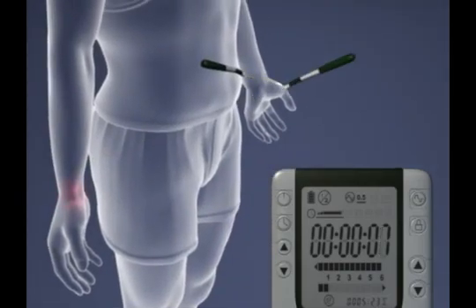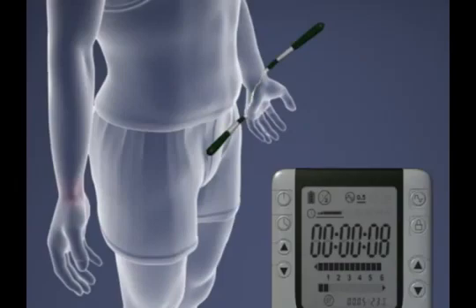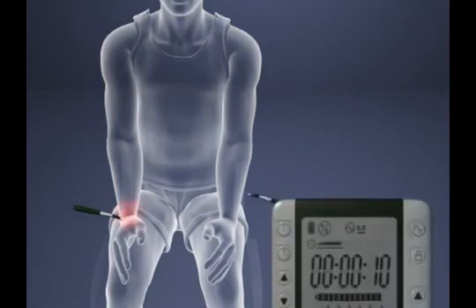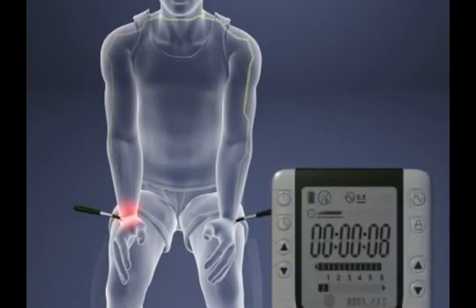Treat the same body part on the opposite side in at least 2 places, such as the other elbow or wrist. Connect the 2 sides by placing one probe below the treatment area and the other in the same place on the opposite side. Repeat in a few places.